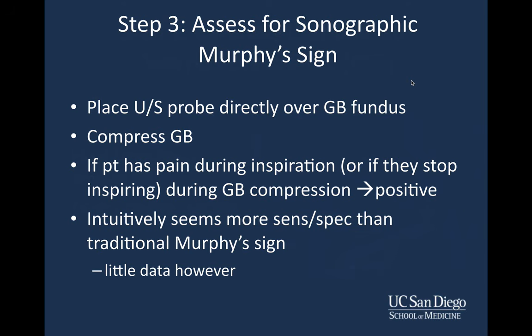It indicates that there is inflammation in the area of the gallbladder. Intuitively, this seems like it would be more sensitive and specific than the traditional Murphy sign. However, there's not a lot of data to support that statement.